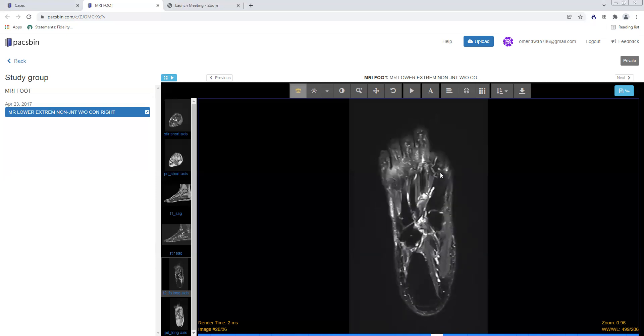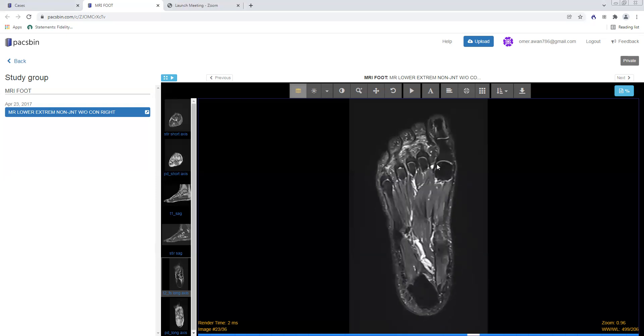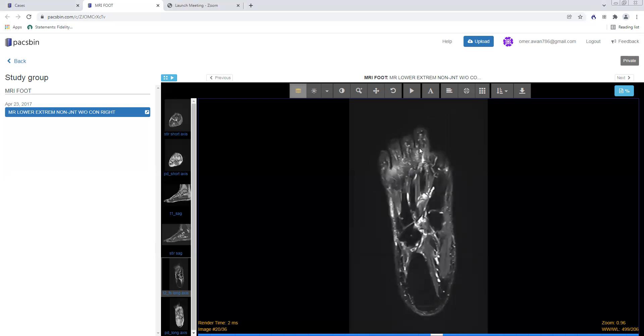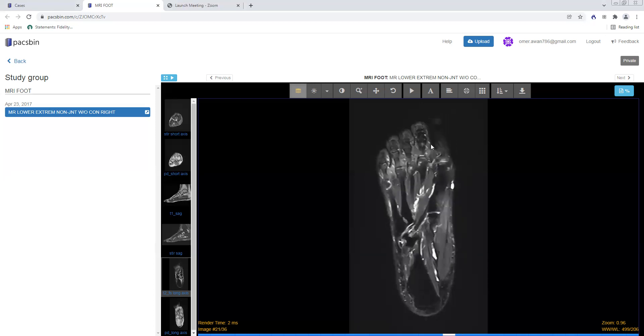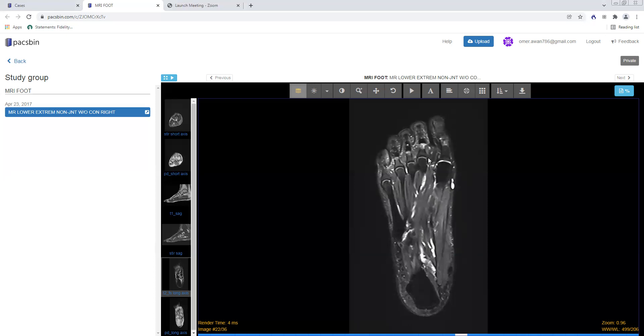Another very important thing on the axial long axis images is to assess the collateral ligaments. All of the MTP and IP joints have a medial and a lateral collateral ligament. This curvilinear dark structure between the first metatarsal head and the base of the first proximal phalanx is the medial collateral ligament at the first MTP joint, and this is the lateral collateral ligament. All MTP joints, IP joints, PIP and DIP joints, and the IP joint at the first digit have them. You're looking for thickening, a partial tear, or a complete tear, which would show as bright fluid signal disrupting the collateral ligaments.